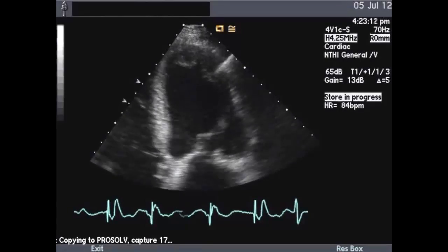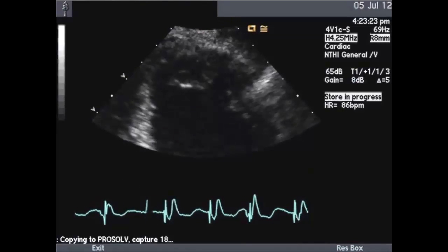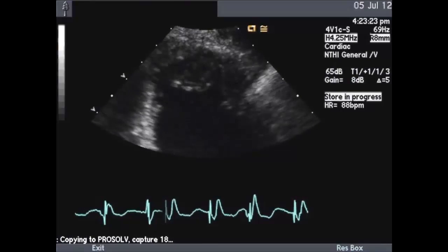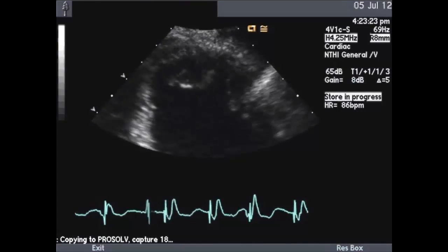And the endocardial border, besides the apex, is pretty clearly seen, but they're really questioning the apex. Case number 1. And this is just a nice resting picture of the apex. So do these images answer the question, specifically apical thrombus?